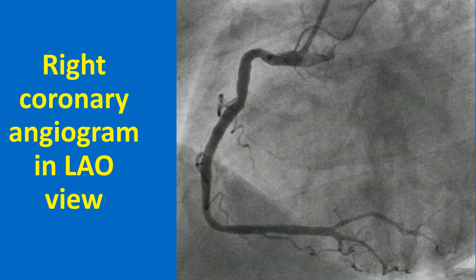The LAO view usually shows the full length of the right coronary artery in a C-shape. Distally, the right coronary artery divides into PDA and PLV at the crux cordis, which is the junction of the atrioventricular and interventricular grooves posteriorly. The artery which crosses the crux is defined as the dominant coronary artery. Right coronary dominance is much more common than left dominance. Even when the right coronary artery is dominant, the major portion of left ventricular myocardium is supplied by the left coronary artery.